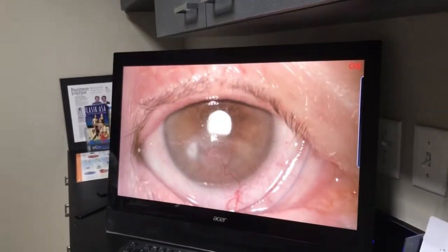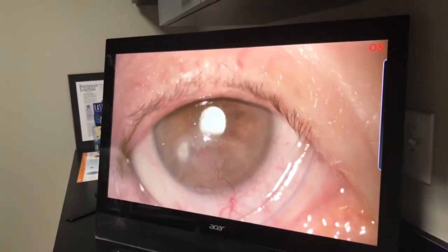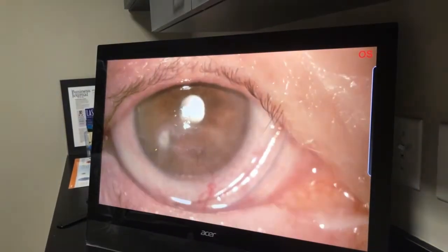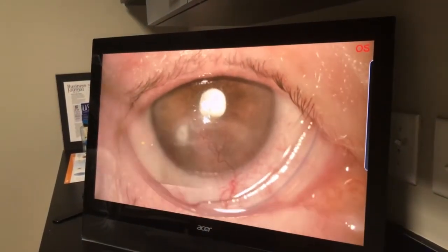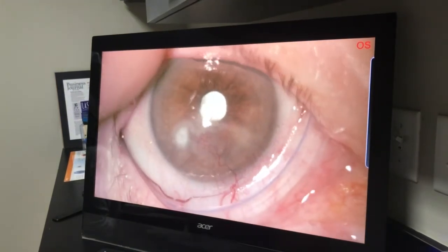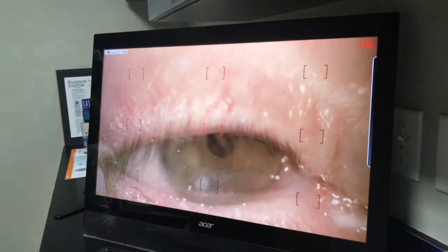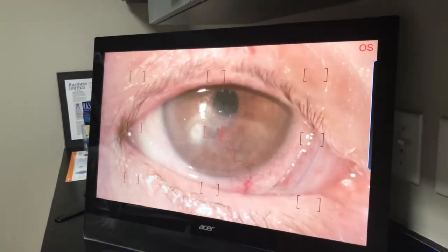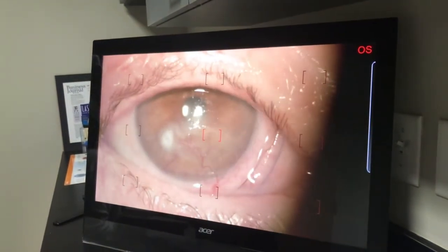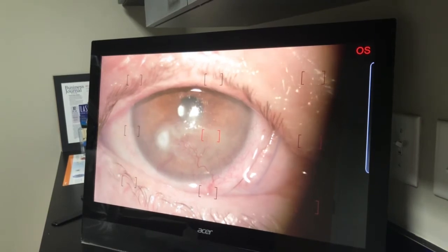So you can see here the Prokera — here she is. We put this in on Friday; today is Monday. It's getting more and more comfortable as it adheres to the shape of her eye and conforms to it. It's nicely covering the area of concern — her neuropathic ulcer. And even with her eyelids that have undergone blepharoplasty, even though the eyelids don't open much, she is comfortably enduring the Prokera ring.